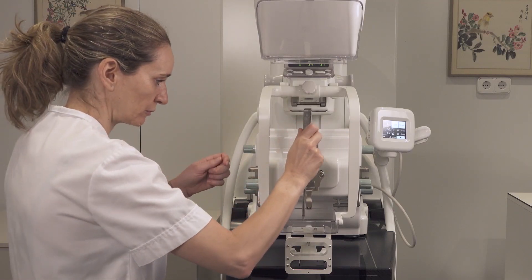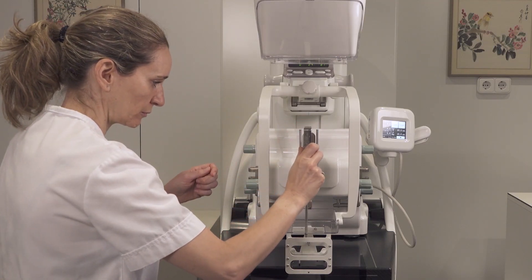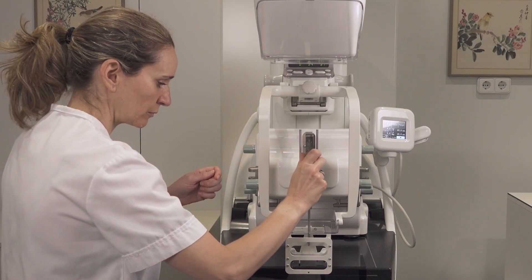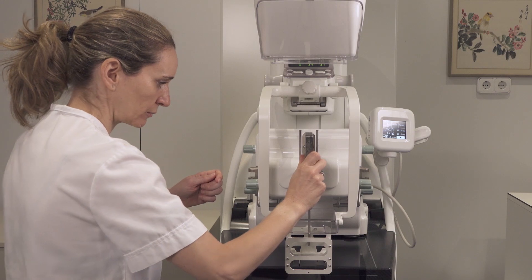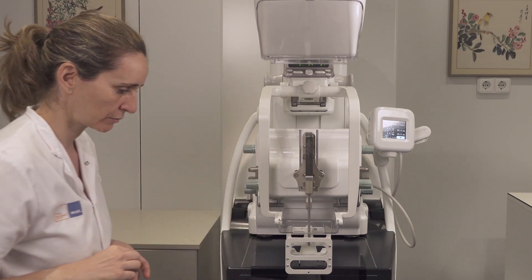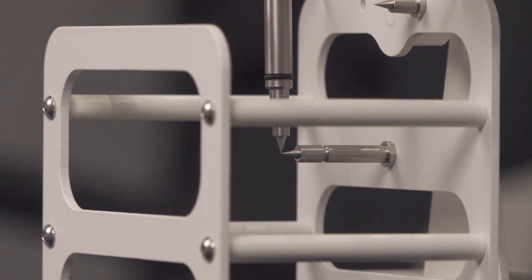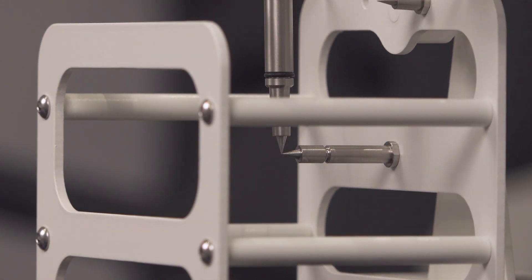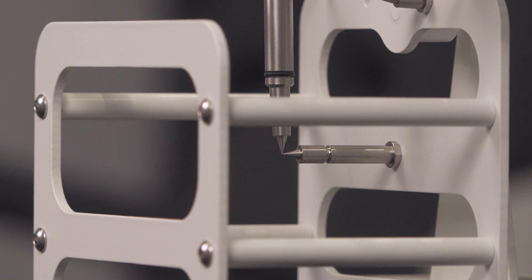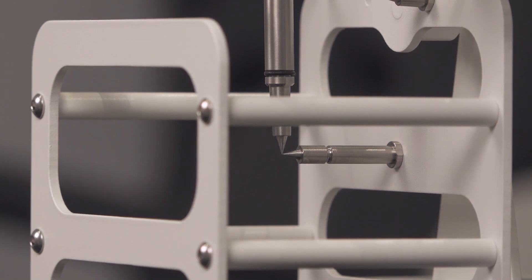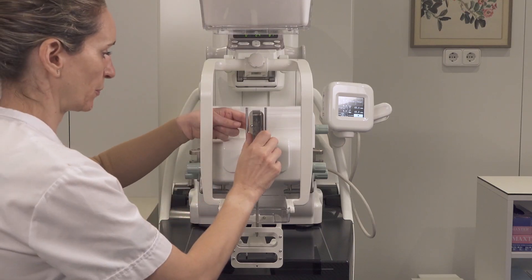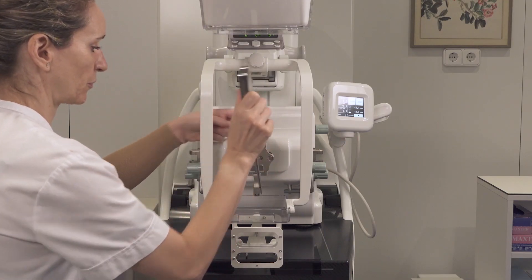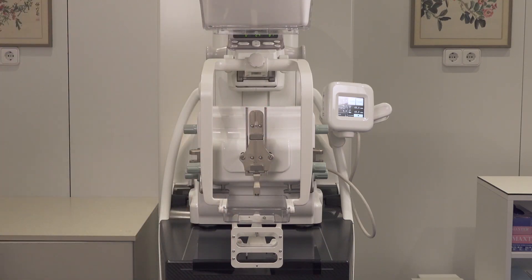Attach the calibration needle to the needle holder. The tip of the calibration needle should touch the tip of the target. Remove the calibration needle when done.